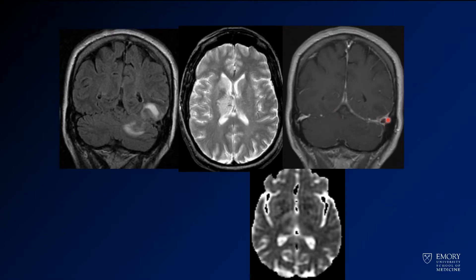What this triangular abnormality that we're seeing here represents is non-filling of the transverse sinus right at the transverse-sigmoid junction. That's probably a thrombus in the transverse-sigmoid junction there.